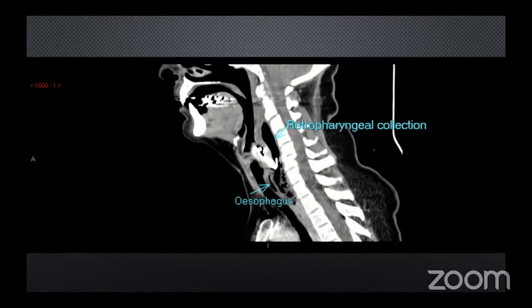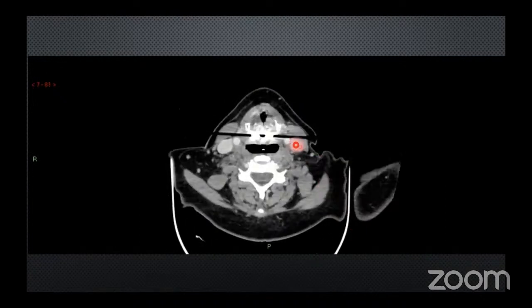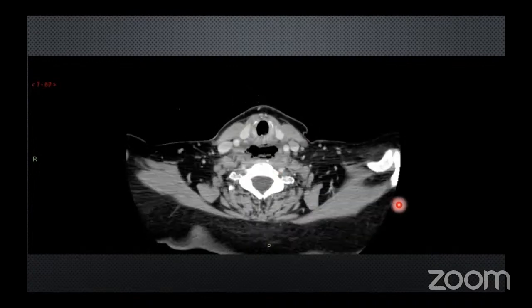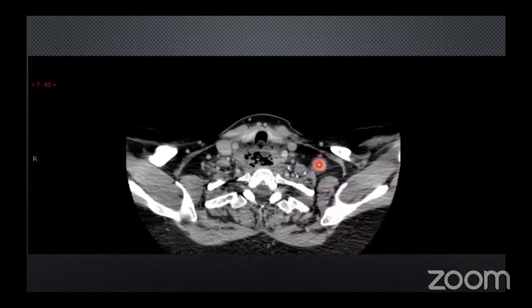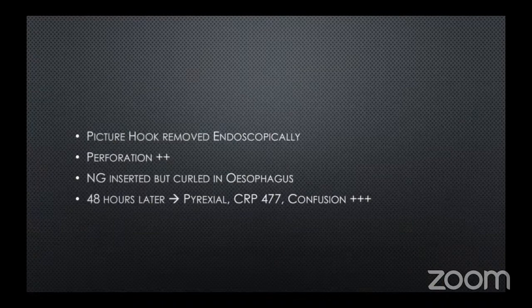that was dislodged in the upper margin of the cricopharyngeus and penetrating the posterior wall of the pharynx at the cervical esophagus at C4, C6 level. And as you can see here, she has a retropharyngeal pocket of air, and further down you can see a fluid level, fluid collection. So the picture hook was removed successfully endoscopically.